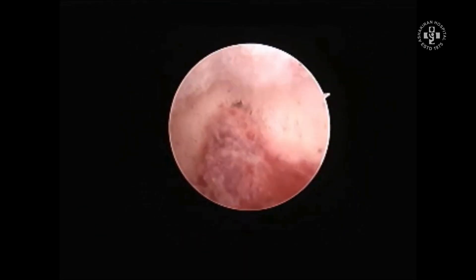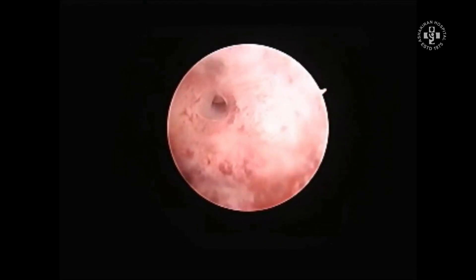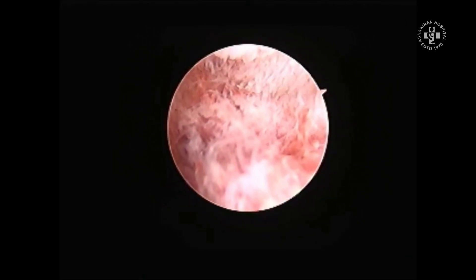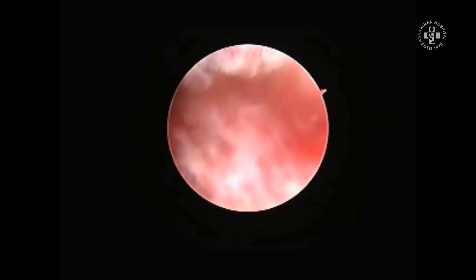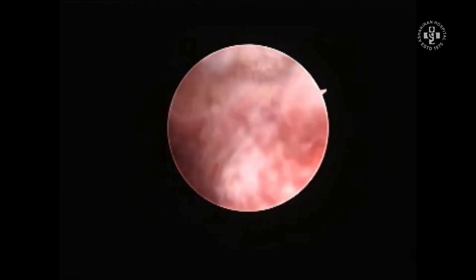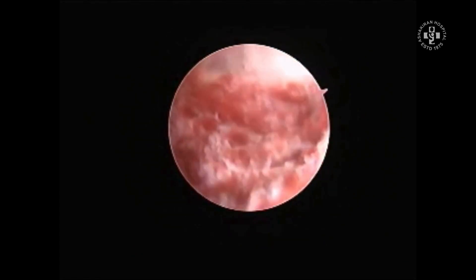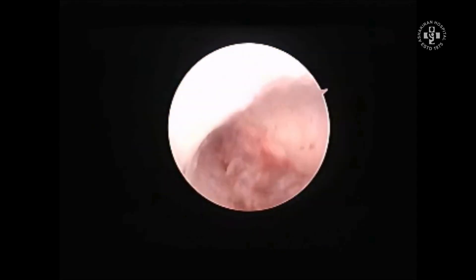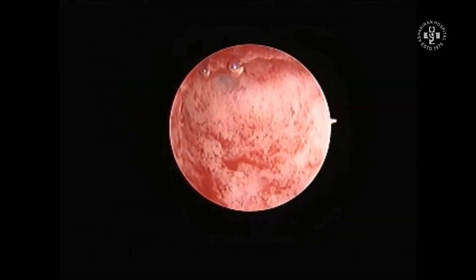With the pressure effects you can see what is the dynamicity of the ostia. If the ostia is dynamic, it means that the tubes may be patent, and it may give you an impression that the fertility of this patient is of good importance when you just do a hysteroscopy without a laparoscopy.